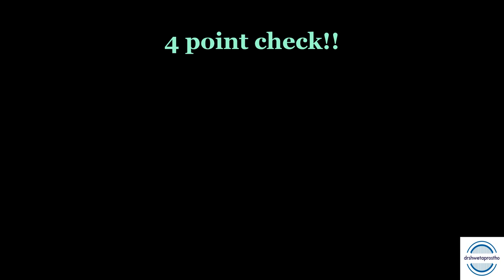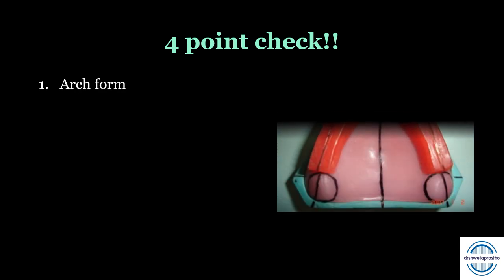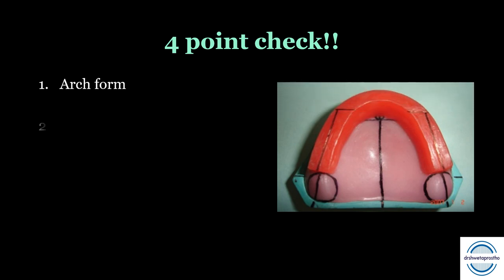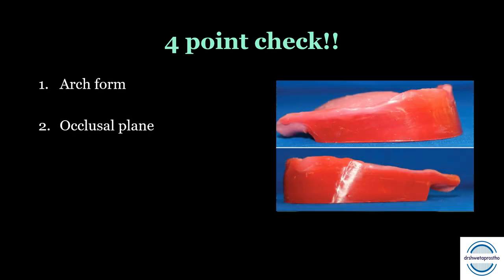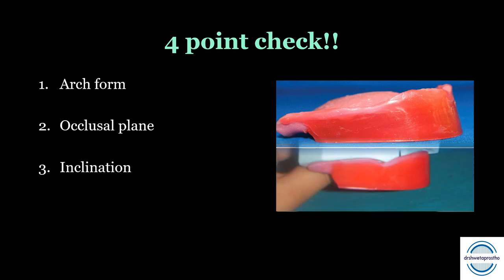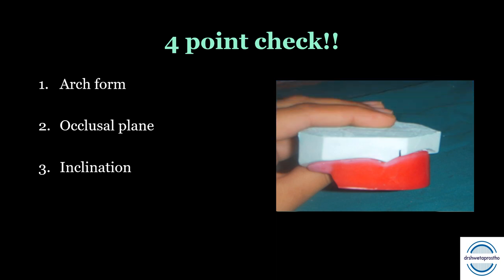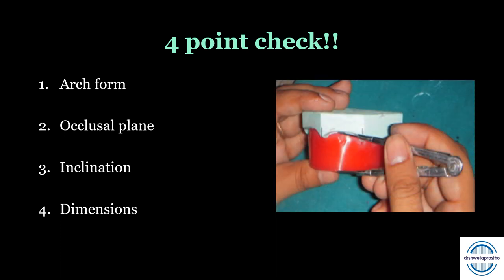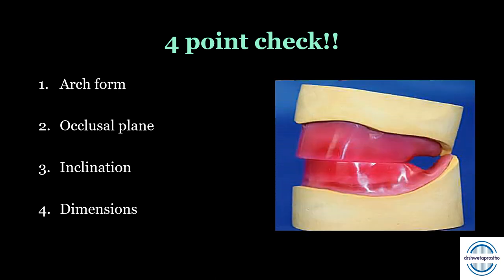Four things to check in your occlusal rims before taking them to your mentor for approval: first, the arch form — the contour of the rims should match the patient's arch form; second, the occlusal plane — it should be even, which can be checked by placing it on a glass slab; third, the inclination — upper rims inclined 10 to 15 degrees anteriorly, lower rims nearly vertical; fourth, the dimensions. Finishing and polishing is also very important for good grades.